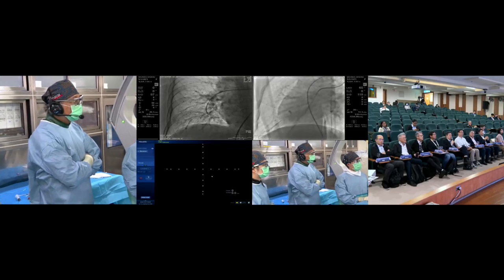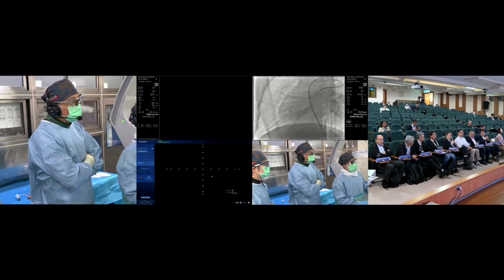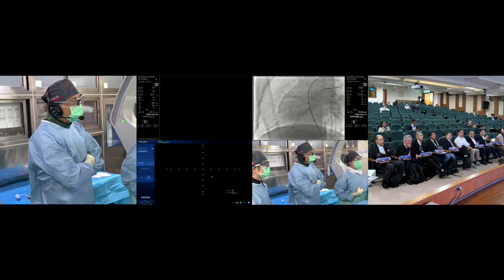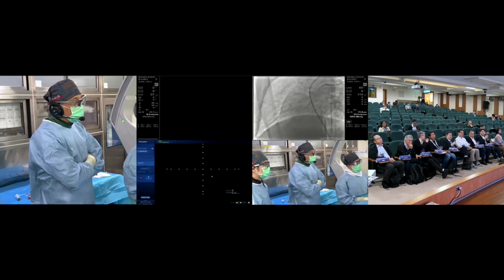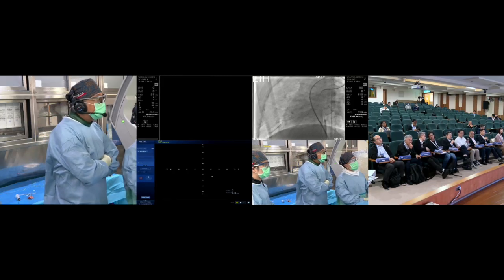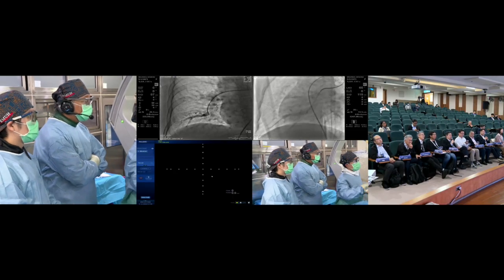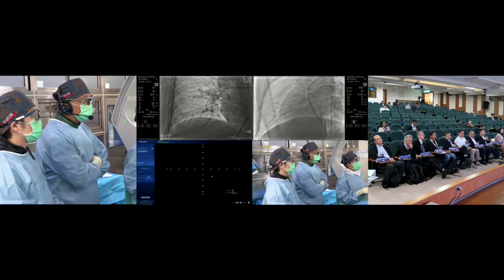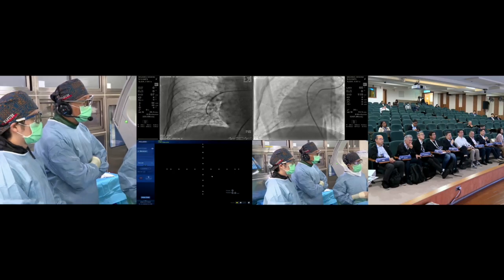Sorry, I just want to show you that in this lesion, this area, the perfusion is actually already good enough, so we don't target this one. This is A9. Which A is it? This is A8. Yes, A8, more lateral, 7, 8, 9. Yeah. Okay.